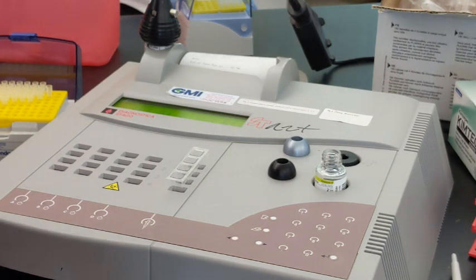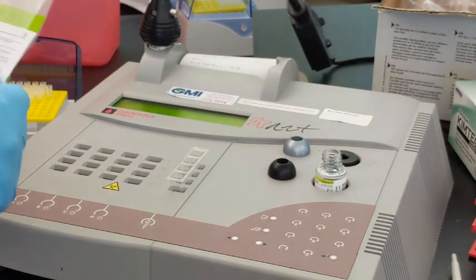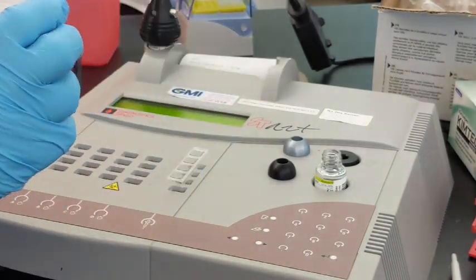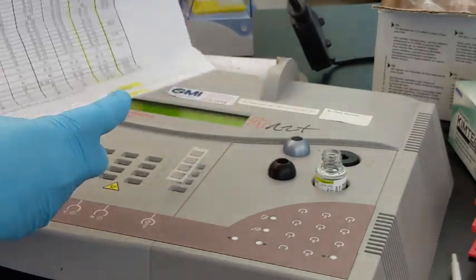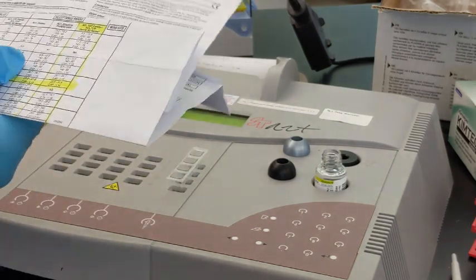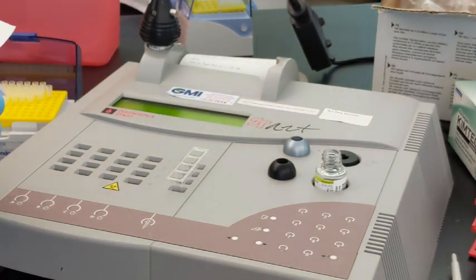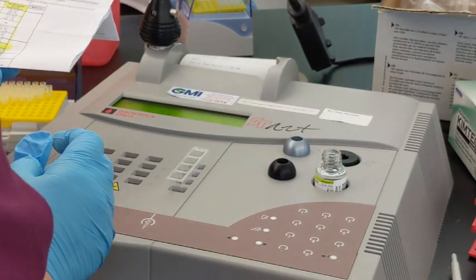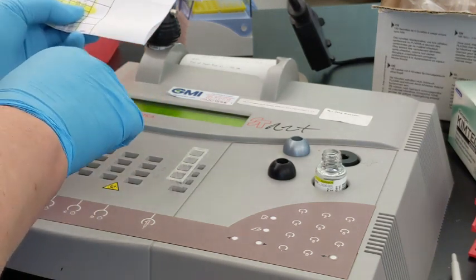And so we're going to go ahead and we're going to compare our results to the lot number for the various controls. So when we're dealing with the normal control assay, it's very, very important that we find the proper control and lot number, and sometimes you have to search on the insert, and then you have to find the right reagent that you're using. And so I should have had anywhere between 25.9 to 33.9, and so my normal control, yay, is in.